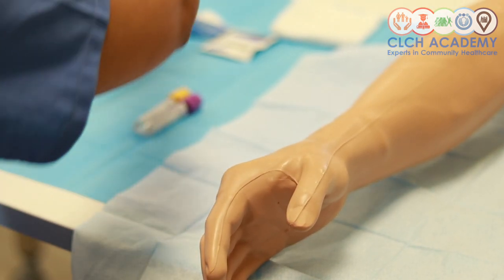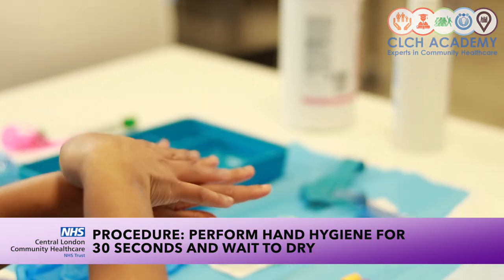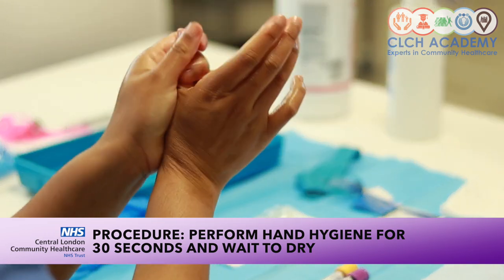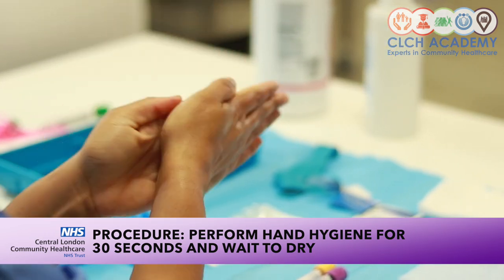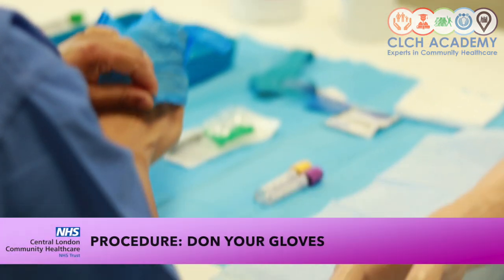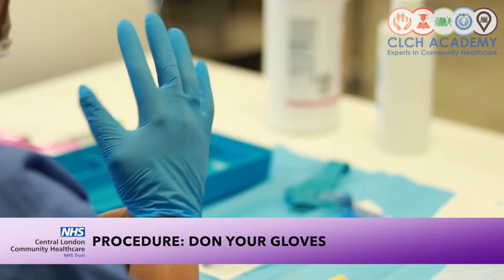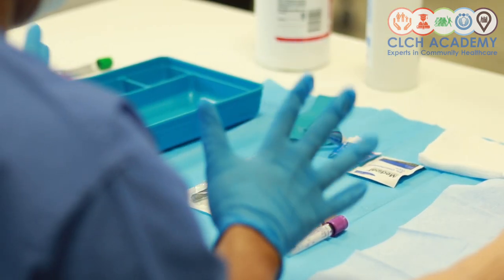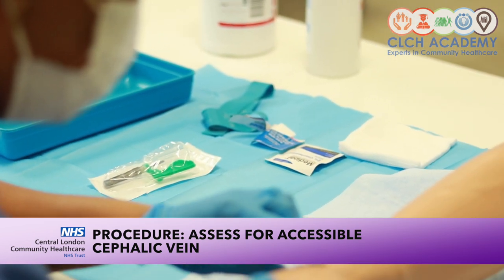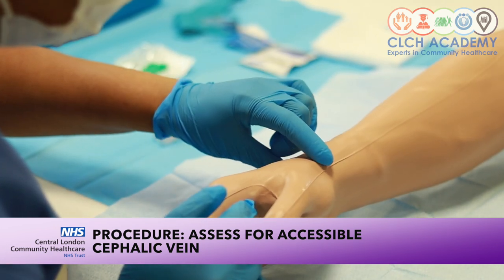Once again, I'm going to decontaminate my hands. I'm waiting for that to dry. Okay. First things first, we'll pop our gloves on. Second, we're going to investigate and risk assess, so that we see that we've got an accessible vein. So I've got a lovely accessible cephalic vein here.